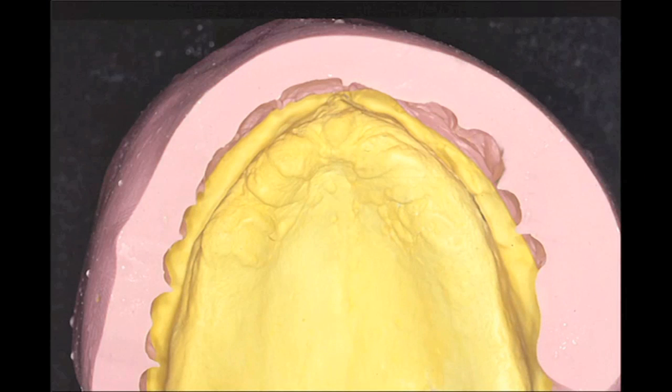What I did here was I made her denture, I transferred her denture information to the master cast, and one of the landmarks that we can use is the incisal papilla as an accurate landmark to measure where tooth position is. And if I took her old denture and measured her tooth position from the incisal papilla, we came up with about 9 millimeters from the incisal papilla to where her maxillary anterior facial portion of the tooth was.